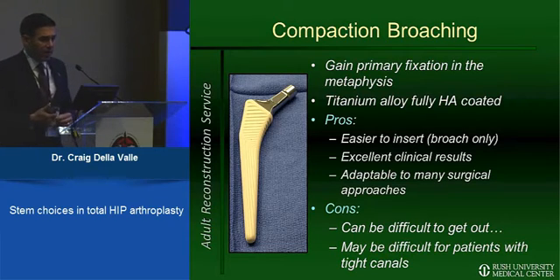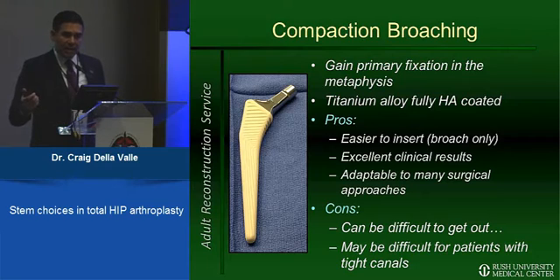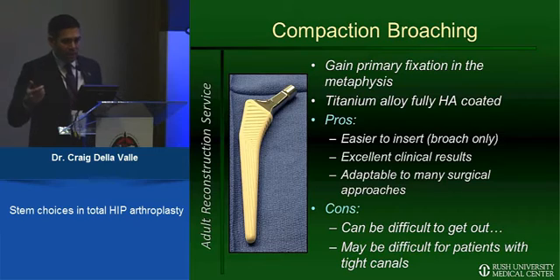In general, these stems are made of titanium and fully coated with hydroxyapatite. It's a broach-only technique, so it's quick and relatively easy. Excellent results have been reported from most centers, and I think it is adaptable to just about any surgical approach.